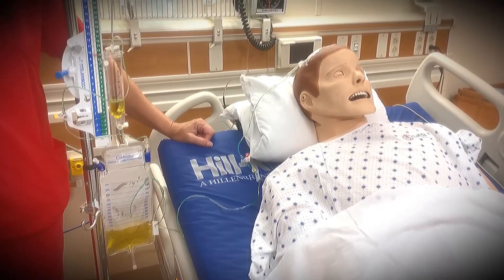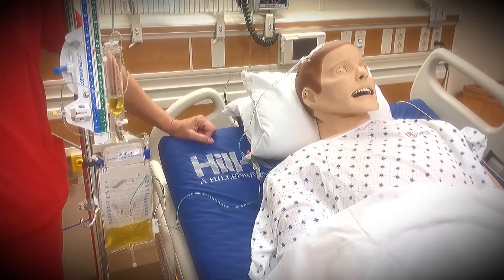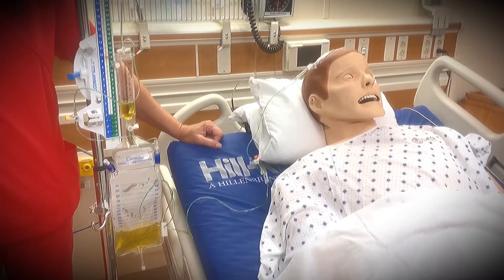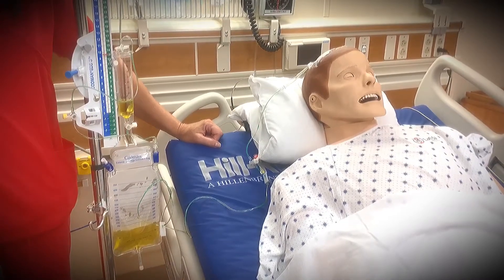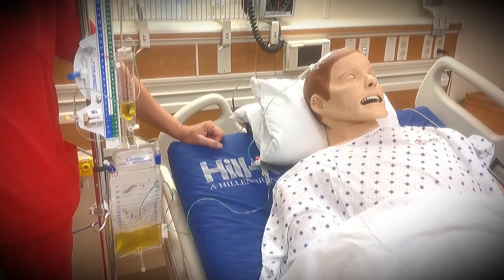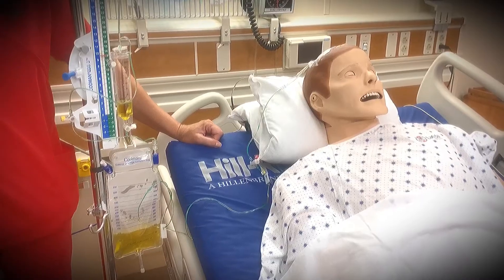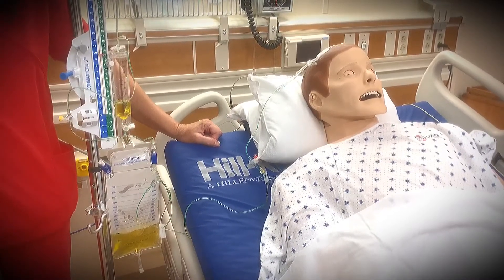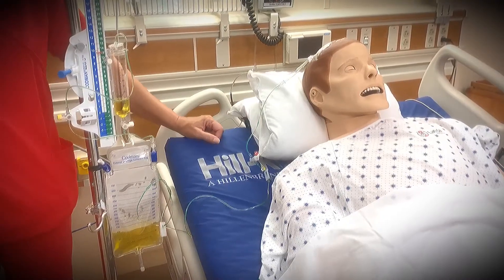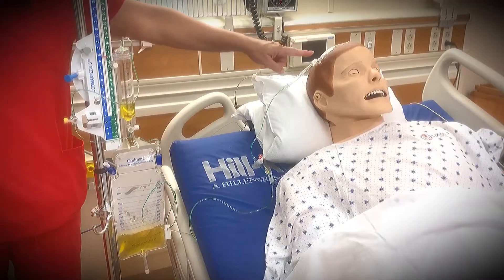The first order of business prior to starting my assessment is for me to look at my physician orders. My neurosurgeon has ordered for it to be leveled at the external auditory canal, for the drainage to be left open at all times, and set at 13 centimeters of water above the external auditory canal — or EAC or tragus — all the same spot.